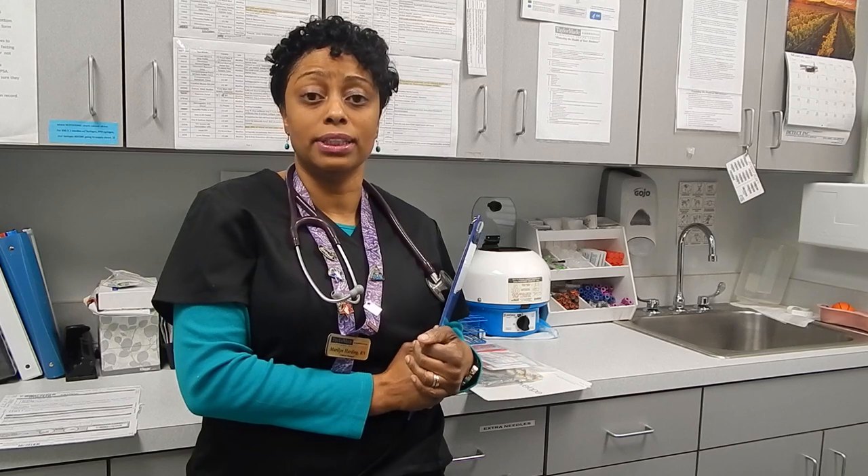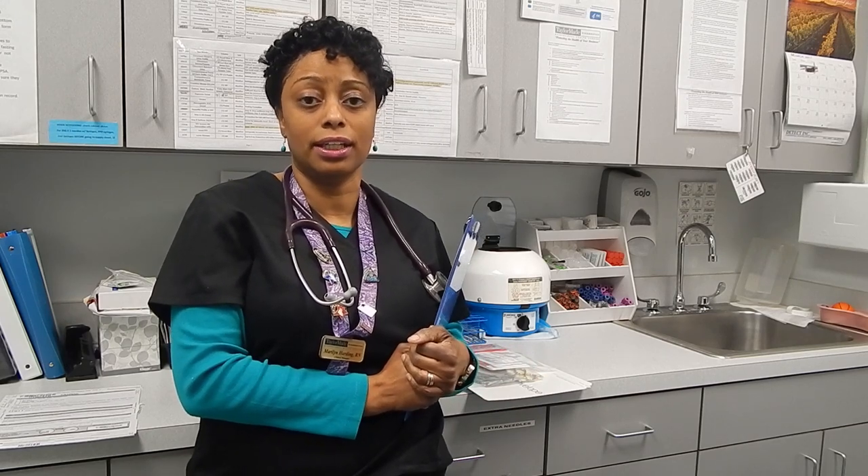Good morning, my name is Marilyn. I'm clinical manager here at TaylorMade Diagnostics. This morning I'm going to be performing a hair collection. Oftentimes employers will have employees come in to have a drug test collection done and they opt to use the hair collection method.